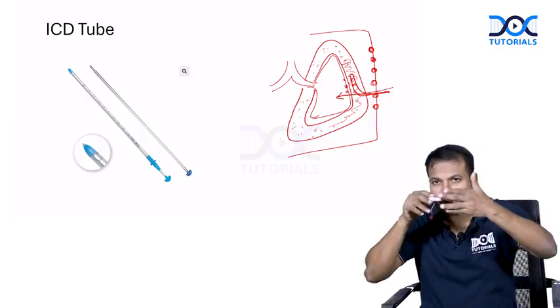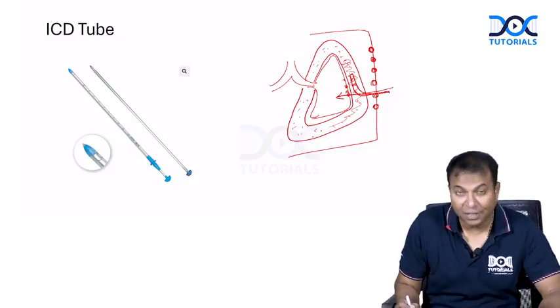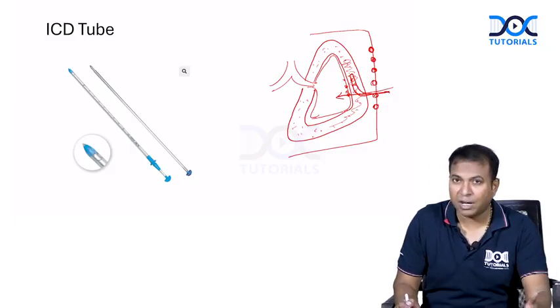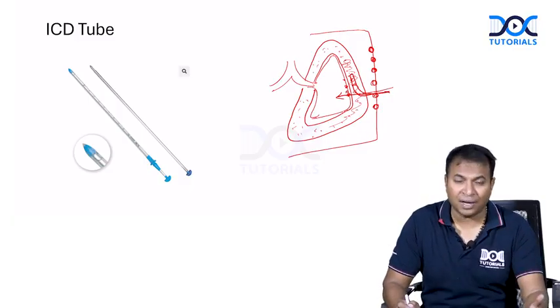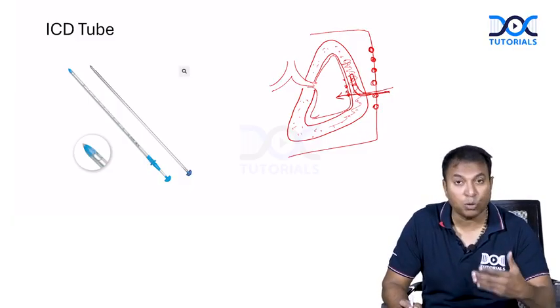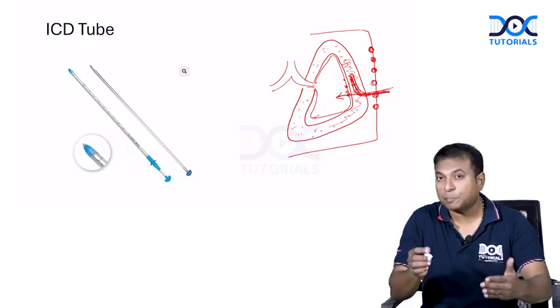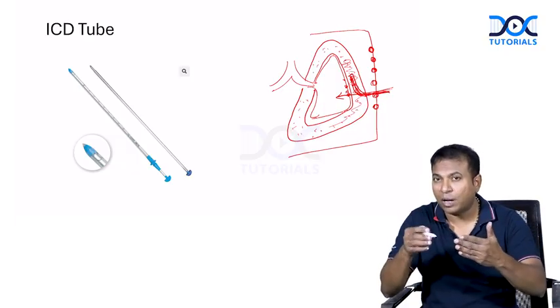So when I am going to enter through the ribs, I should not go and forcefully puncture the lungs, which is already injured due to trauma or some other reason. The lung is already injured, leaking air in a pneumothorax or leaking blood in a hemothorax. Something is already happening. We should not go and cause more damage. So please remember, we should put a tube in this space, and to put it in this space, I should be very careful. I should not go and poke the lung.